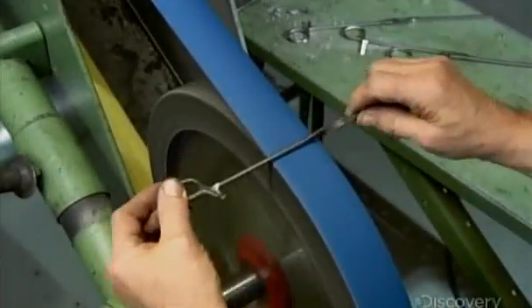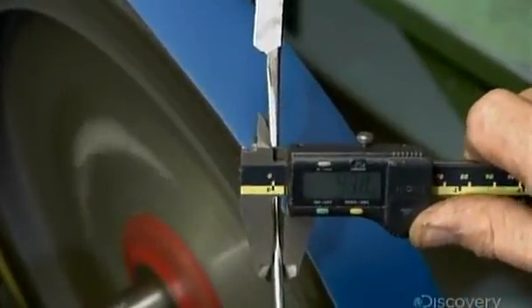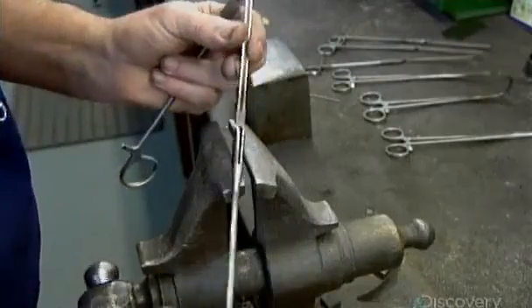Precision is again critical, as the worker grinds each of the tool's shanks to the correct thickness. He measures to confirm that the size is consistent along the length of the part. He then files the joints so they mate perfectly.